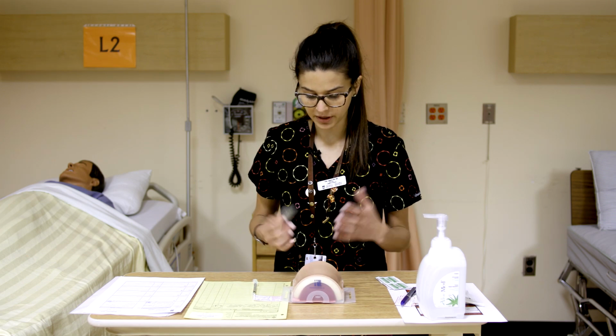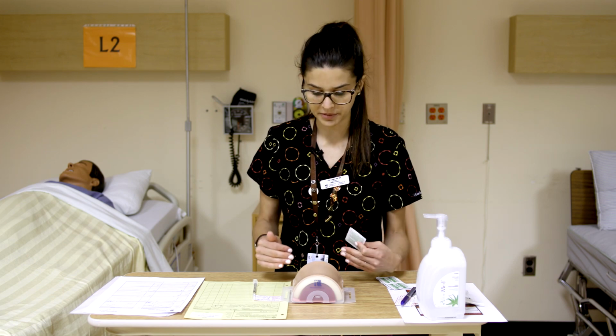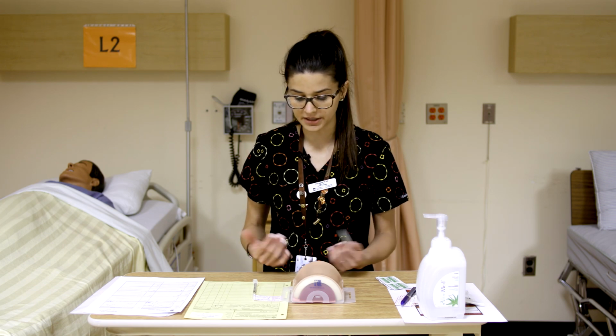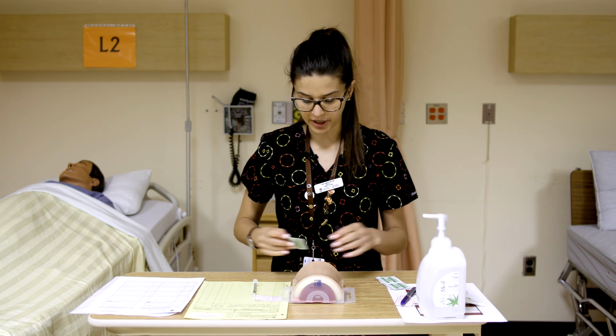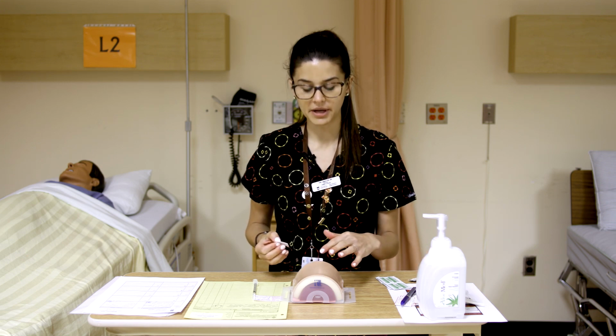So we have an alcohol swab. You can wear gloves for this. I'm not going to, just for demo purposes, though it is an injection, so that's a likely risk. So it is a good idea to wear gloves. So we'll clean our hands. We brought an alcohol swab for this one, and we're going to choose a site on the patient that's appropriate.